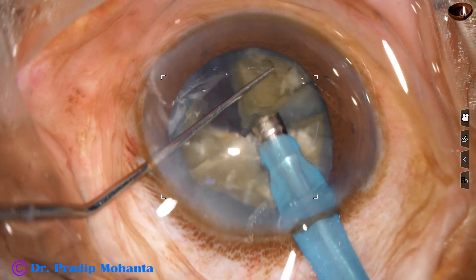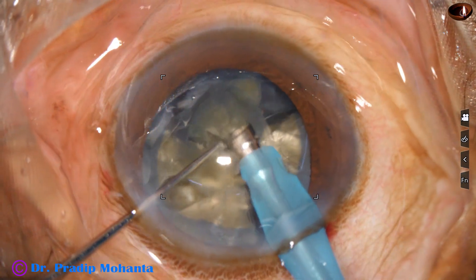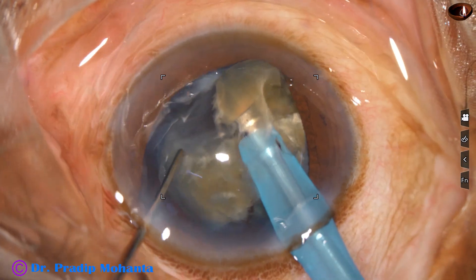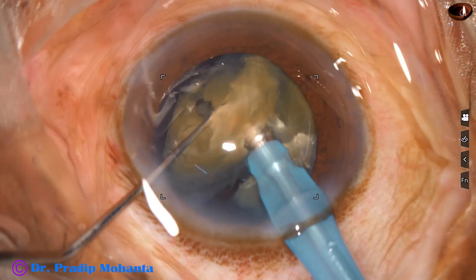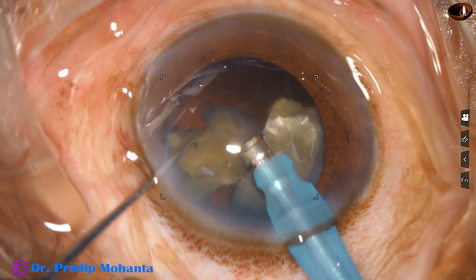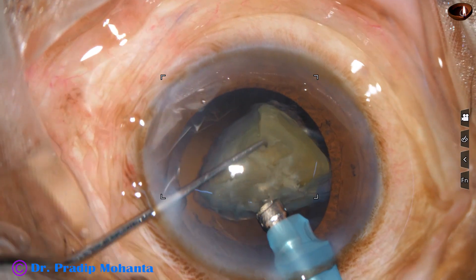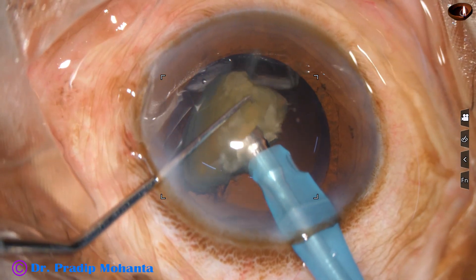In this case, the ultrasonic energy being used is 85% in continuous linear mode. Flow rate is 45 ml per minute and vacuum is 450 mmHg. The machine being used is Oatly Catarix III — no financial interest — but this is a nice machine for direct chop. For sculpting, machines with torsional ultrasound are better, but for direct chop, this machine is very good.